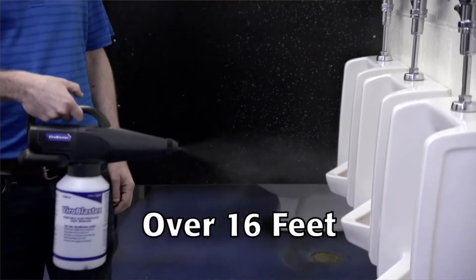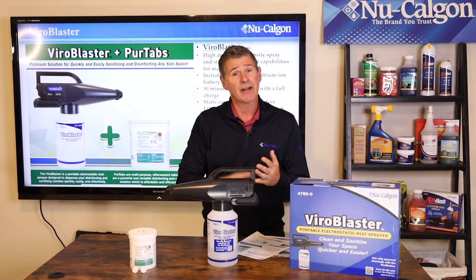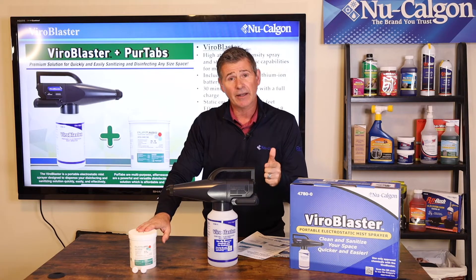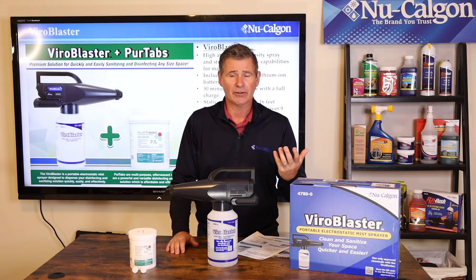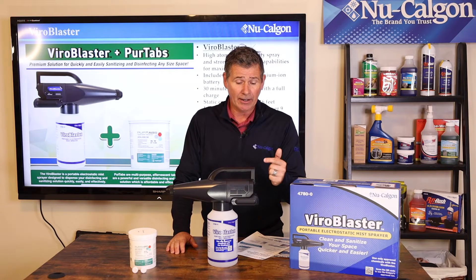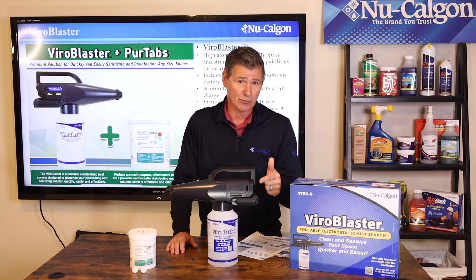This really puts out an incredible electrostatic mist spray that's going to sanitize and disinfect when you've got the PureTabs on the inside. It is going to come with a lithium-ion rechargeable battery — the same type of battery you'd see in your cordless power tools.